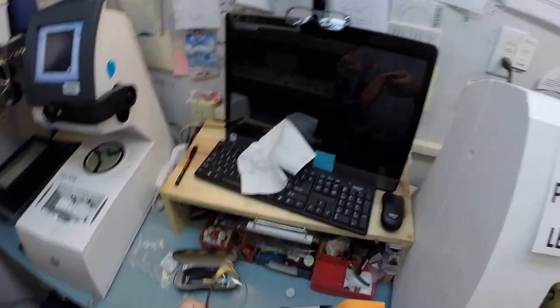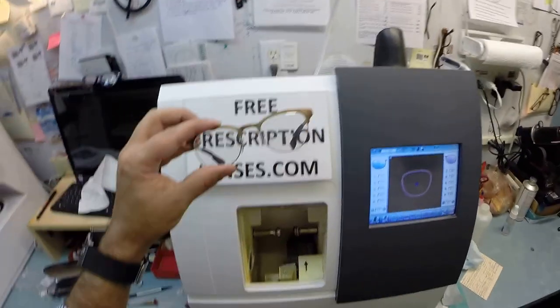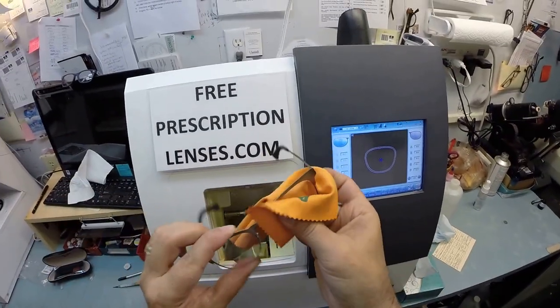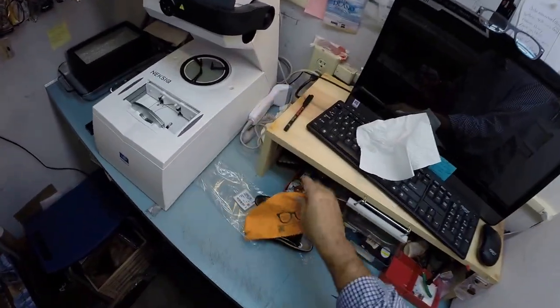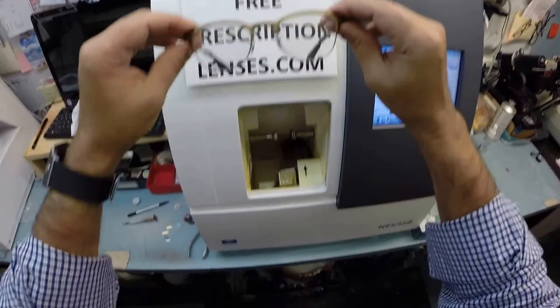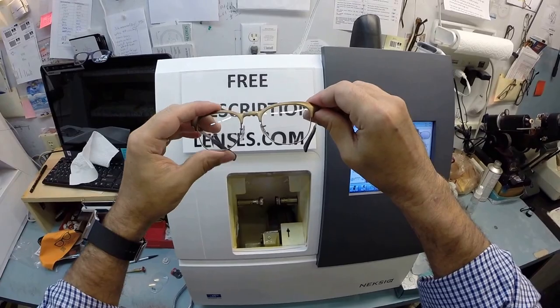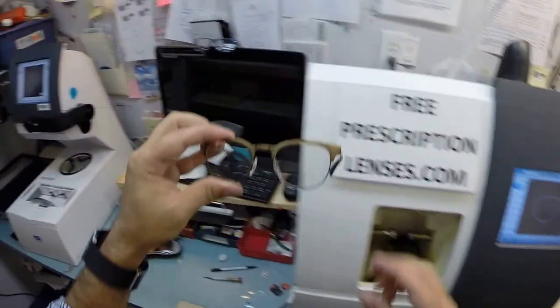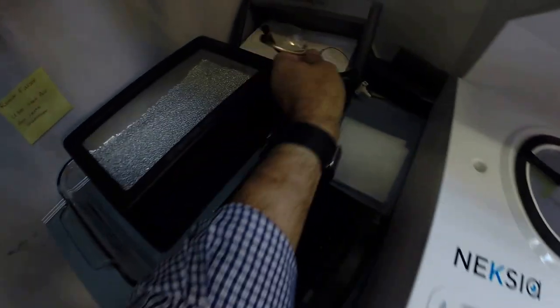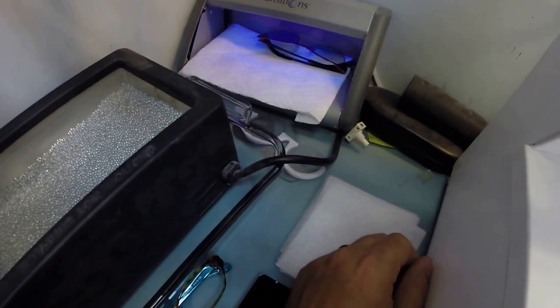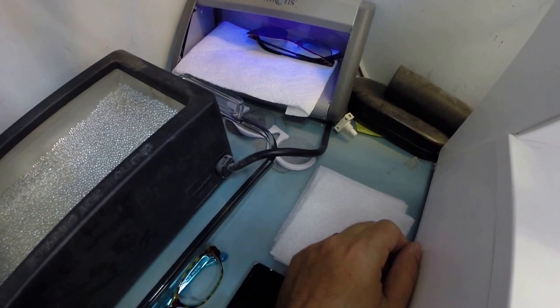Mark, I'd love to have you rocking these with the mountains in the background. And of course, I field test every cleaning cloth to make sure it works before I send it to you. And you are getting your Broncos orange on here. Hopefully you're a Broncos fan. But this is what your lenses look like clear. I'm going to go ahead and activate the transitions part of your lens, which means I'm going to expose them to a strong burst of ultraviolet light. And I will do that over here in the corner. And as you can see, it takes about 30 to 45 seconds for transition lenses to darken. It takes a little bit longer when you come back inside, 45 seconds to a minute to a minute 15 to return back to virtually clear.